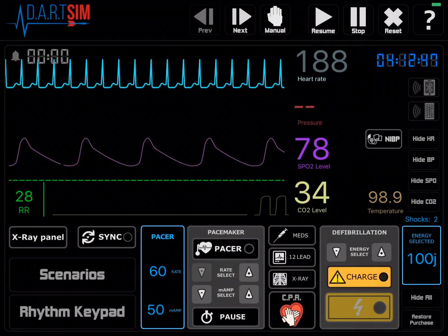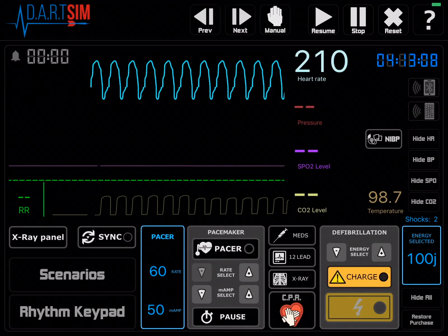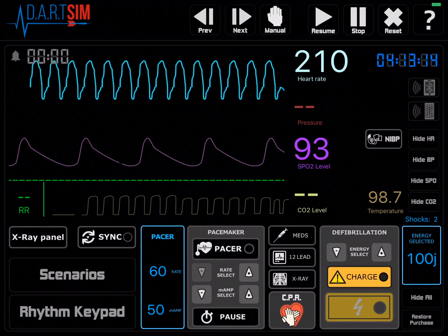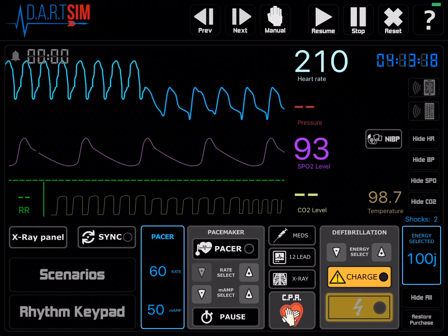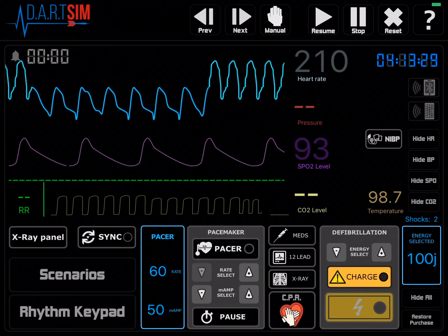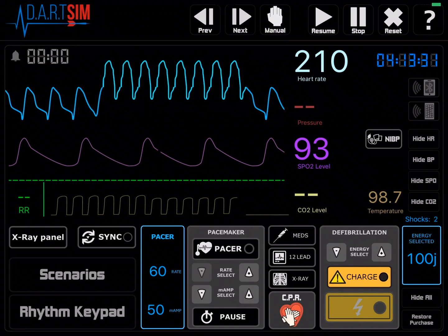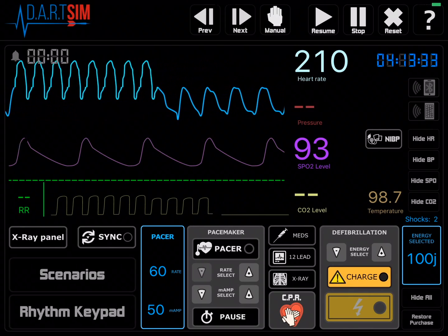Lastly, you should be aware of what the CPR rhythm looks like. Your chest compressions will look like this on the cardiac monitor. When you come off chest compressions, you'll see the underlying rhythm — in this case, ventricular tachycardia. Some students mistake the CPR rhythm for ventricular tachycardia, but it's not. It is your chest compressions, and you'll also note a metronome when it's going. As soon as you come off, you'll see the underlying rhythm.